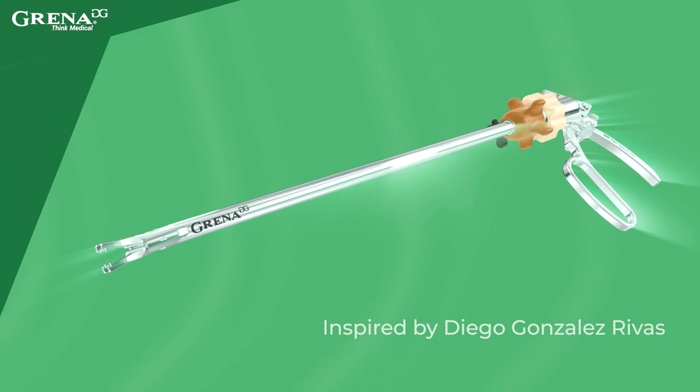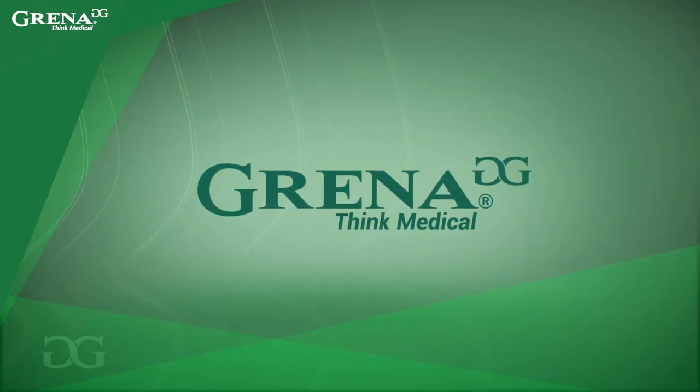A new innovative product from Grenna. Grenna. Think medical.